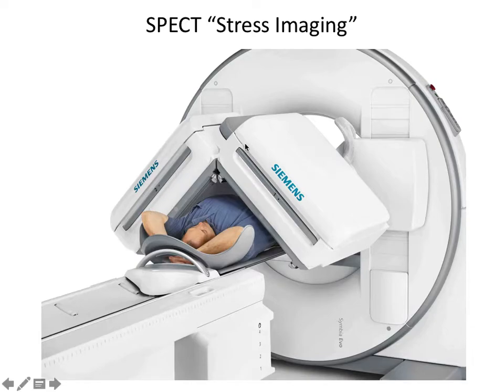This is the basic structure of the scanning system itself. The patient, recall, is the source of this radiation, and so the patient is glowing and shooting gamma rays out in all directions, right? They're going in every direction. And so you would like a detector to cover as much area as possible around the patient so that you collect all of these photons or these gamma rays.